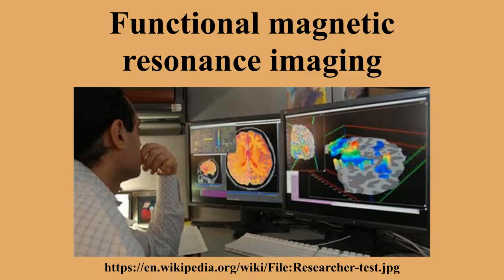Newer methods which improve both spatial and time resolution are being researched, and these largely use biomarkers other than the BOLD signal. Some companies have developed commercial products such as lie detectors based on fMRI techniques, but the research is not believed to be ripe enough for widespread commercialization.